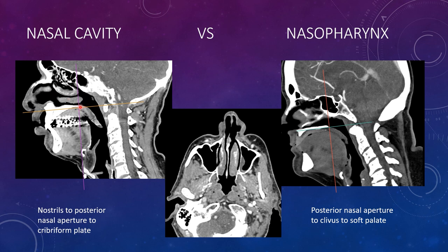Posterior to this, from the edge of the hard palate to the clivus, is the nasopharynx. And here's the nasopharyngeal lymphoid tissue lining anterior to the clivus. Here it is in landmarks — this area posterior to these lines is the nasopharynx. On the axial view, you see the classic components.